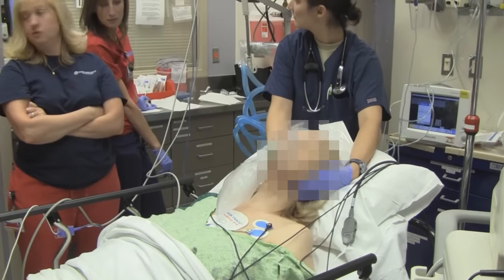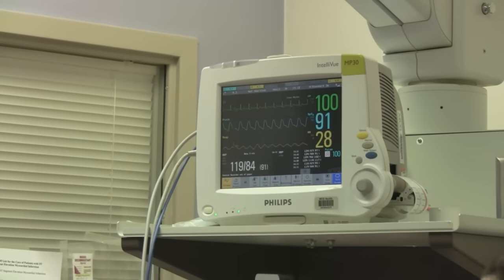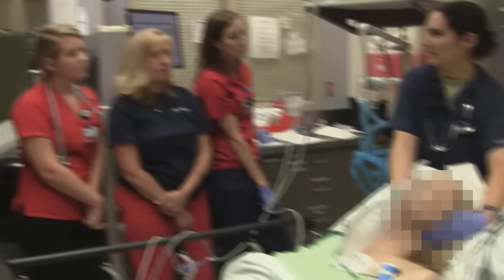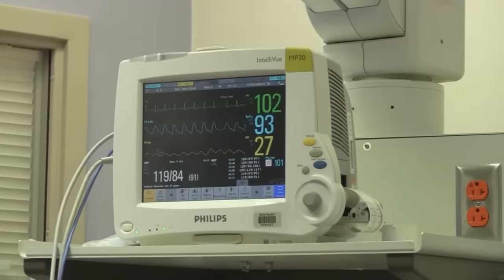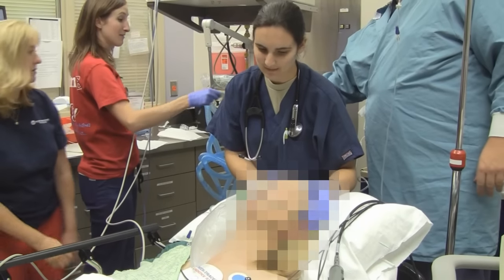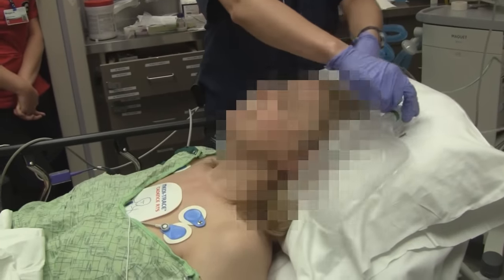Did it stop? Yeah. Okay. It's all done — we're back in a normal rhythm. Did you zap me? We zapped you. You guys are awesome. I'm going to repeat the EKG. You didn't feel anything at all? I didn't feel anything. Perfect.